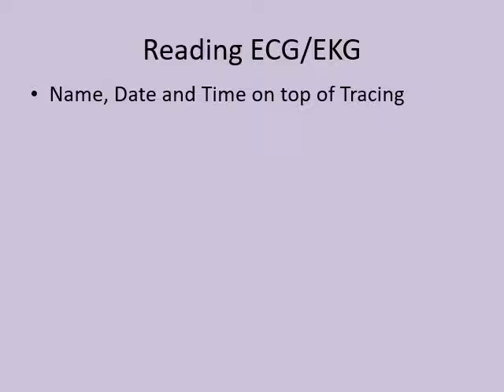First thing in the morning, a couple of minutes later, if you're having a heart attack, whatever, they're going to be looking at you constantly. So make sure you're looking at the name, date, and time. So look at the rate. We're going to do a really easy way to figure out the heart rate. Well, not quite as easy as just looking at the machine and reading the beats per minute, but we're going to look at an easy way to distinguish the heart rate.